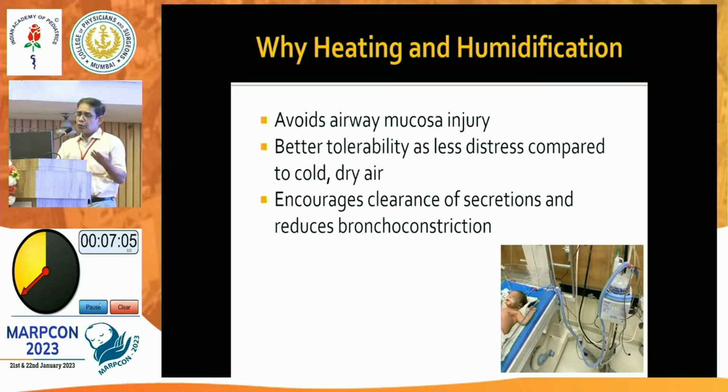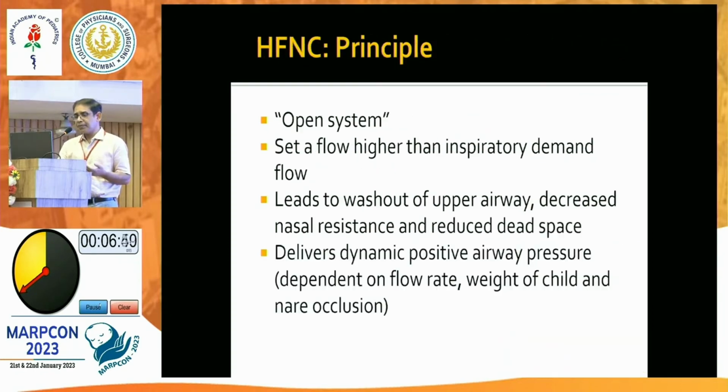That's why we have to not just humidify, we have to heat it also at an appropriate temperature, which is 34 to 37 degrees. So heating and humidification avoids airway mucosal injury and it is tolerated better.